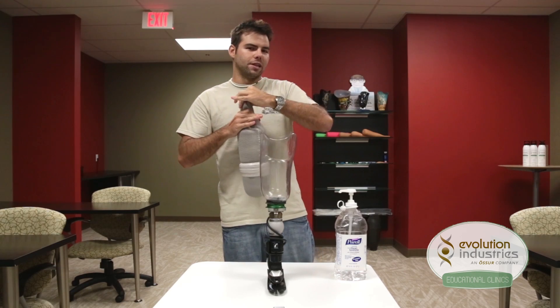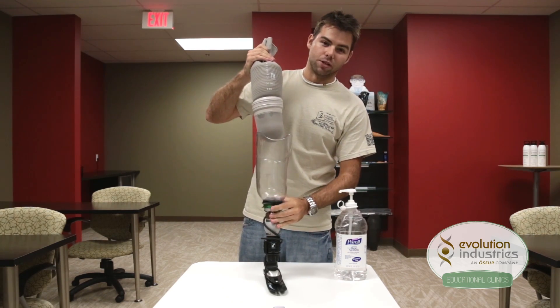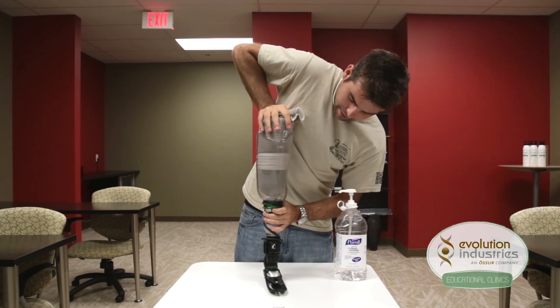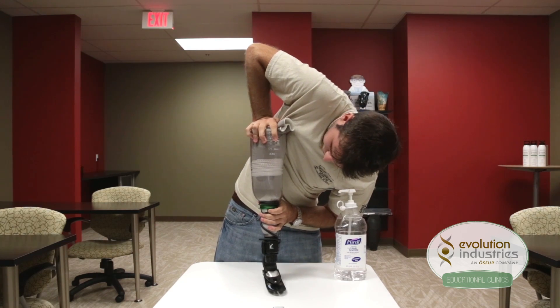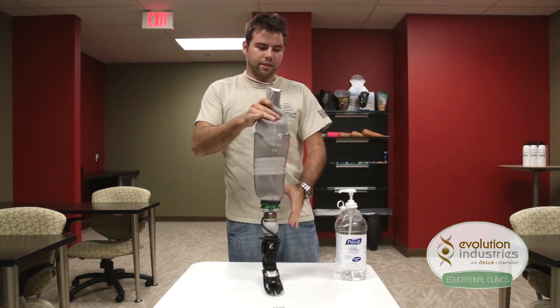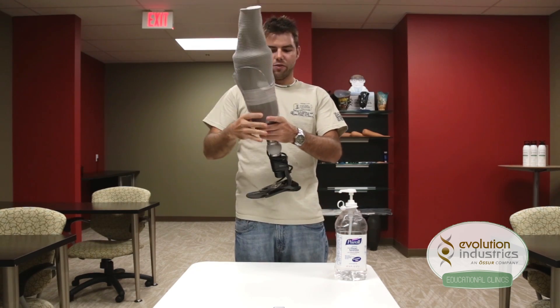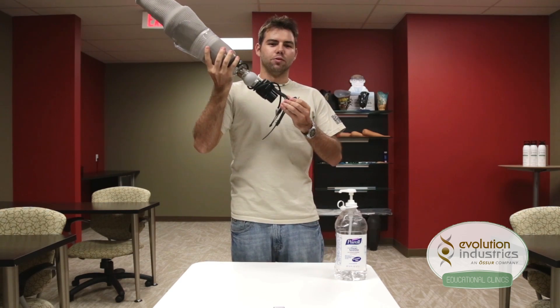Now as the patient steps into the socket, air is going to be expelled out of the distal end. You can press the release valve to expel the air faster. Once they are in, release the button and they are held in suspension. Just have your patient take a few steps on their new Unity foot and the pump will do the rest.